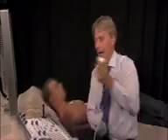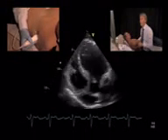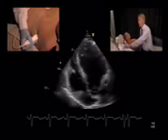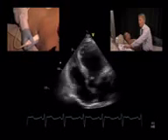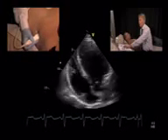I will now show you how to use the continuous wave Doppler spectrum to quantify the severity of aortic regurgitation. And I also want to show you how problems can arise and how difficult it sometimes can be, and what the limitations of this technique actually are. So, in principle, you would start with a 5-chamber view. Try to orient the 5-chamber view in such a way that you have a parallel orientation towards the ultrasound beams.